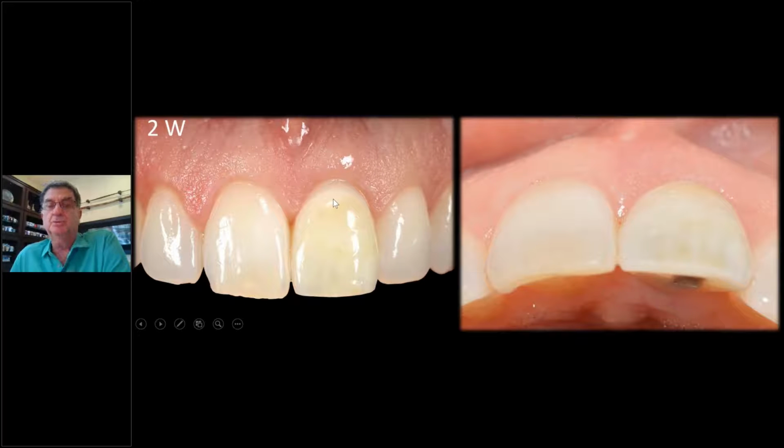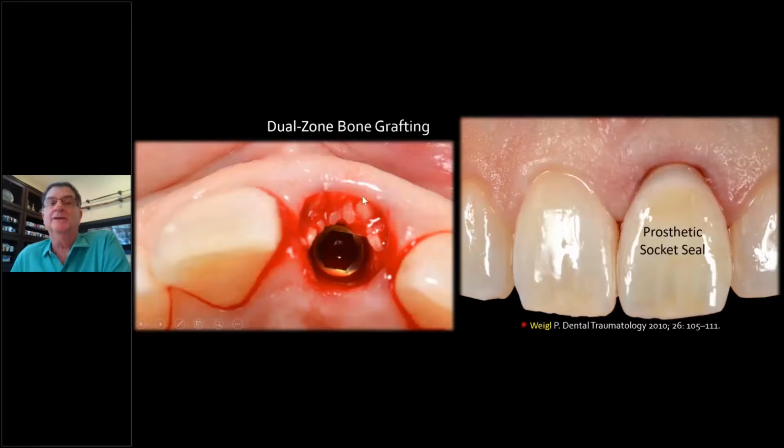Now, the reason why we go dual zone, we're grafting all the way to the height of the free gingiva. Dual zone means up to the bone, in the gap, but also we're bringing it all the way up. I came up with this about 10 years ago because I had some extra material. I said, let me see what happens if I put it up in the soft tissue. And you know what happened? It thickened the tissue, and the particles will heal inside that free gingiva and thicken it. So I don't always have to go for a connective tissue graft. This is the simplest technique I've come up with, with great predictability.